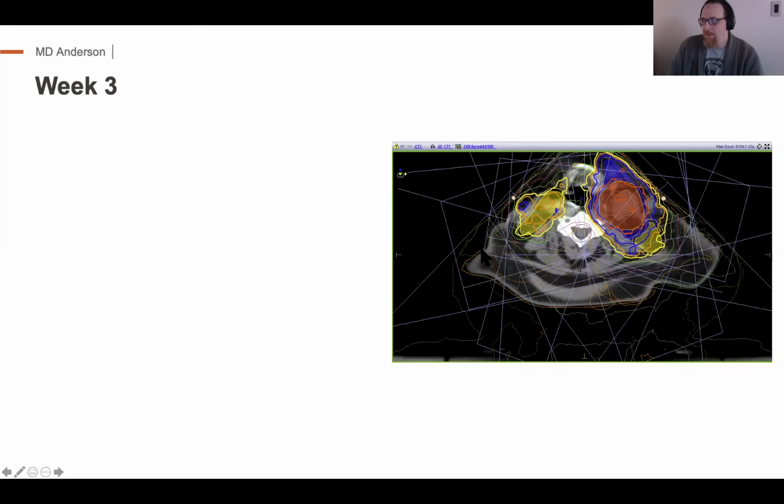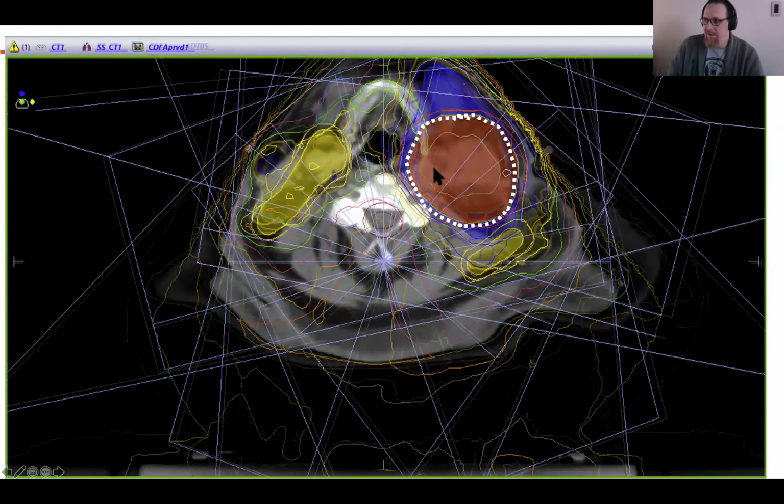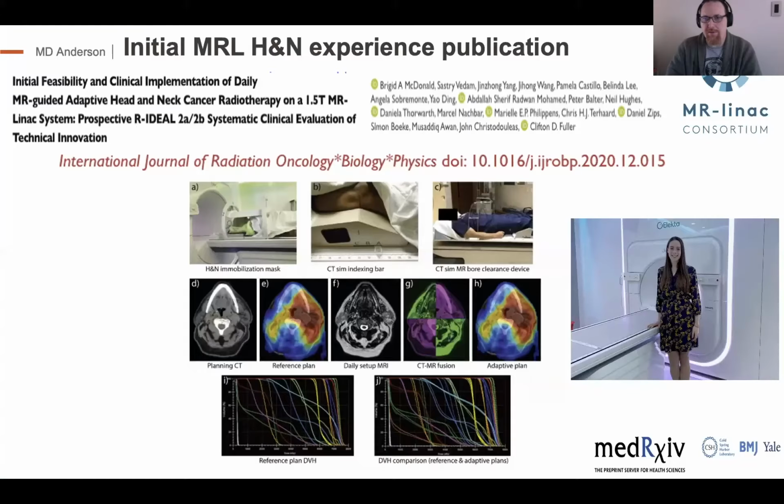When we look at week three, what we saw was that this is the pre-therapy volume, and I've outlined the extent of what we would radiate in high dose pre-therapy, but this is what it had shrunk to. So all of this brachial plexus, all of these additional swallowing structures, all of this laryngeal apparatus really getting blasted for something that's now no longer even remotely involved either geometrically or physically.